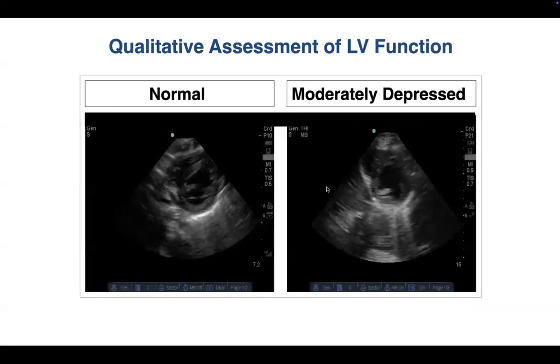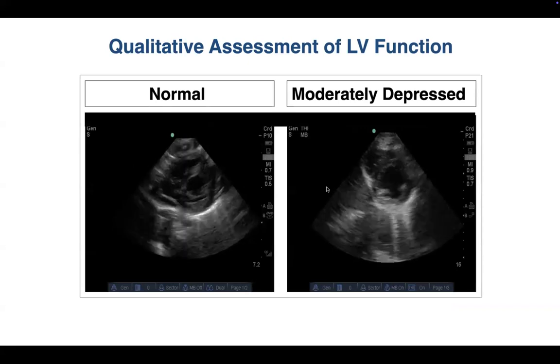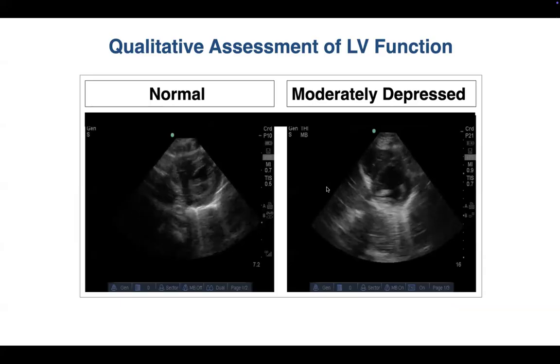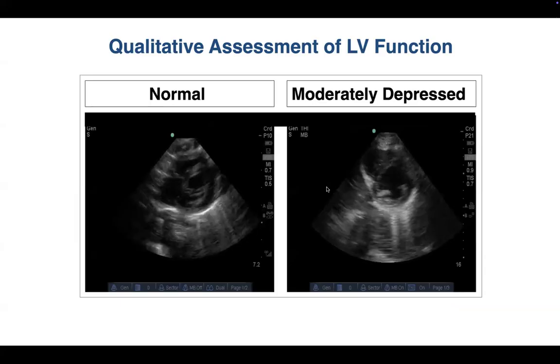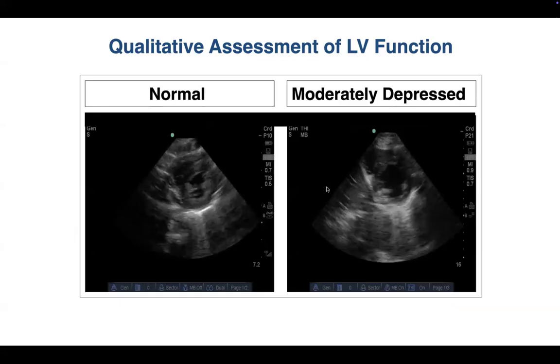So you can see the squeeze on the left versus the squeeze on the right. I don't know if Rini's on, but I can tell that that's abnormal, and that's helpful to know. You don't have to know why, but okay, there's something going on that doesn't look right. I'm going to change my strategy.